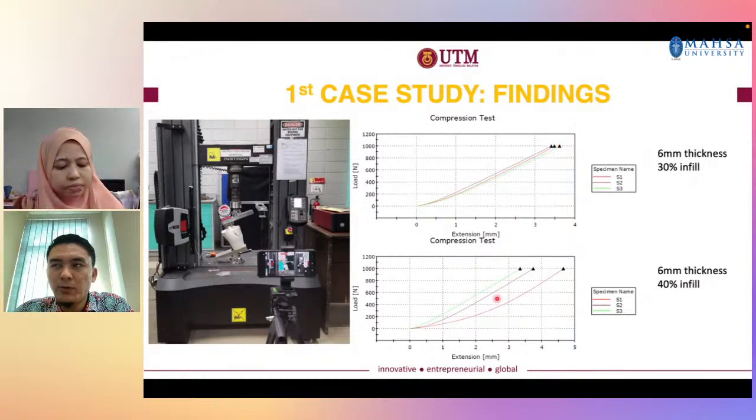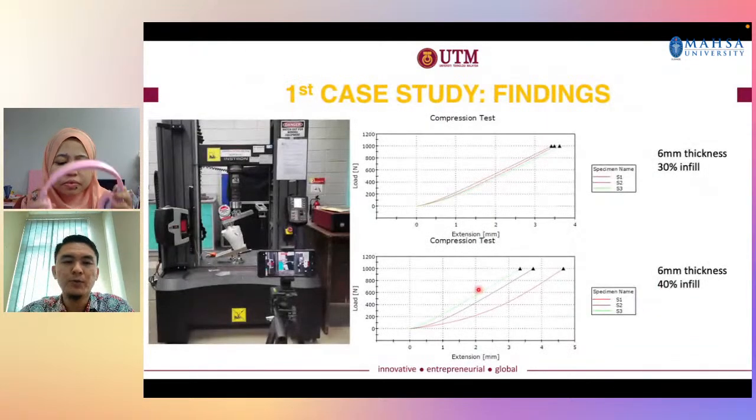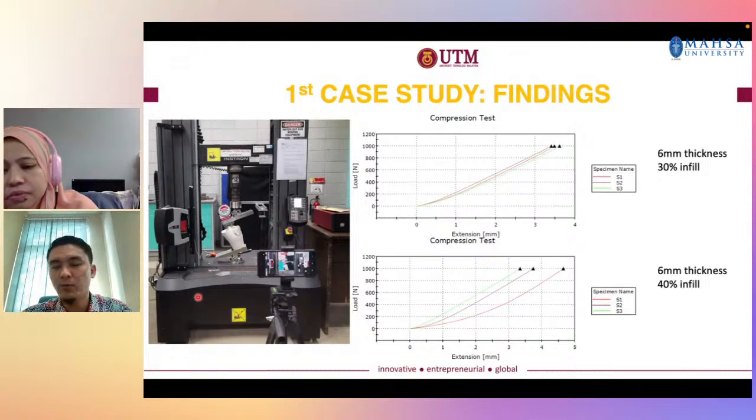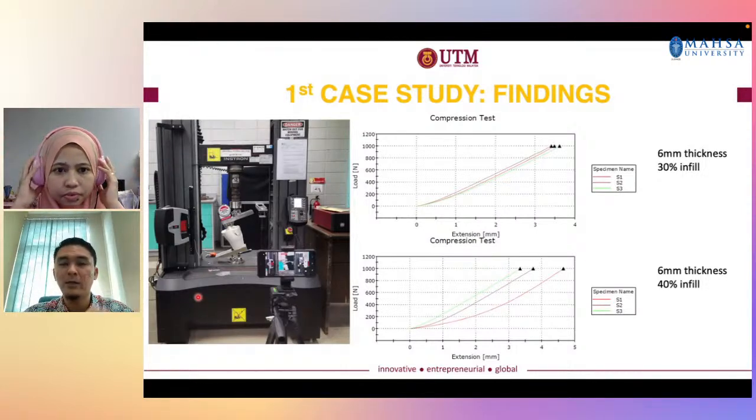40% infill is also no failure. Okay, so from this result, we can say that the socket itself can sustain the load up to 100 kilograms. So it is very strong for a patient having less than 100 kilogram.